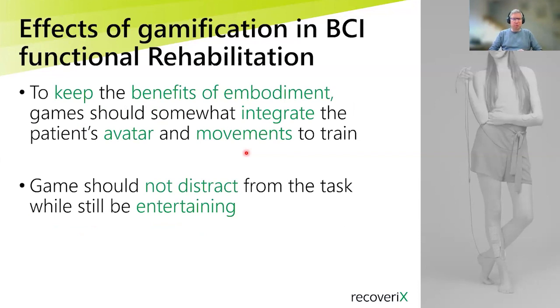There are some caveats, of course. You should keep the benefits of the embodiment. So you should still show the avatar. You should have the idea, the embodiment, that what you see on the screen are your hands.